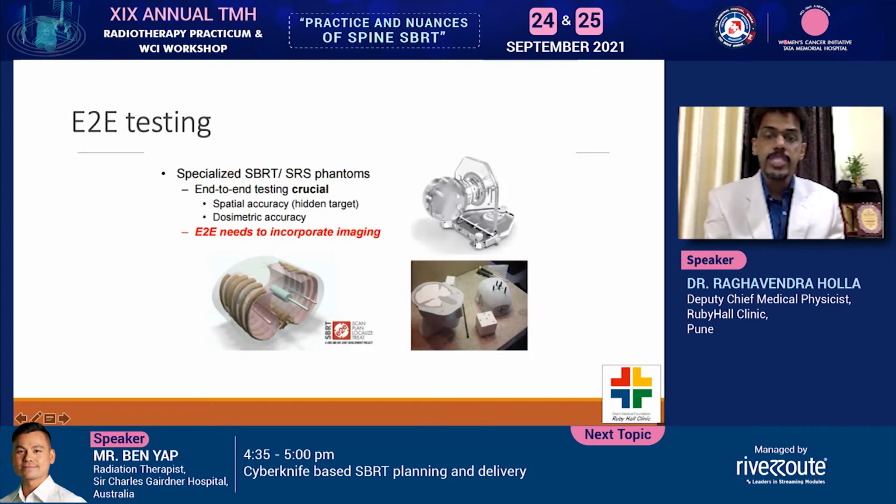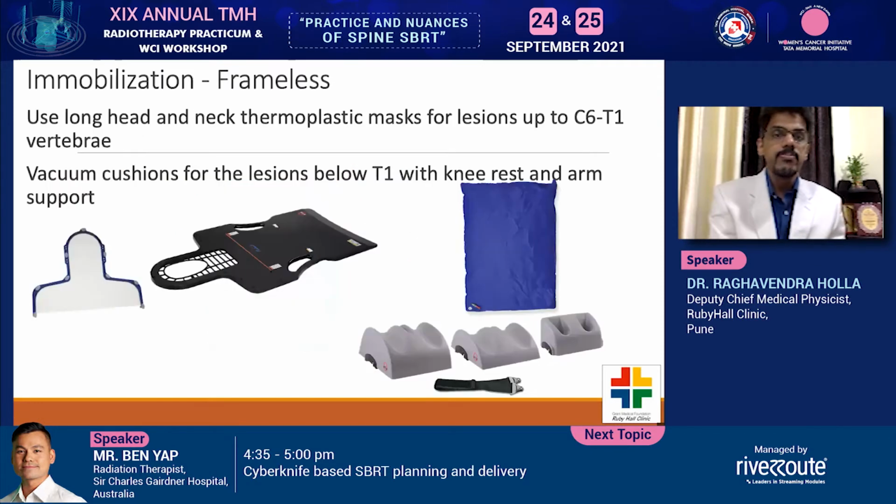Do the treatment planning and deliver it with the linear accelerator, and check whether the dose delivered is accurate enough to continue or not. This is what we call end-to-end testing. This is a must. Once you commission the linear accelerator and do all the tests, finally you validate your process by doing end-to-end testing.